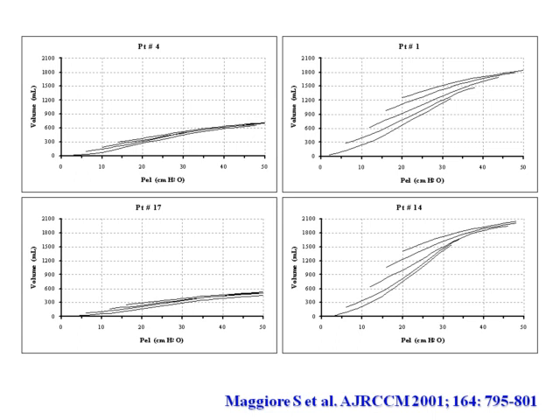Those are pressure-volume curves at different PEEP levels. And if we look at the isopressure, the volume at the same pressure, there is no recruited volume at 5 of PEEP or at 15 of PEEP. Whereas in other patients, applying different levels of PEEP at the same pressure, you will see how the recruited volume in the lung is different.